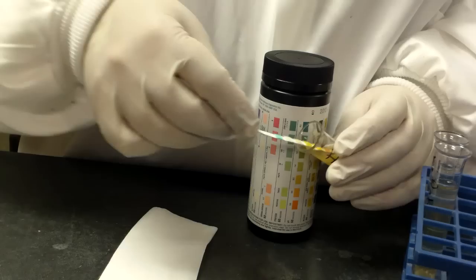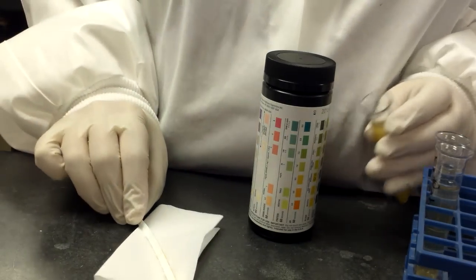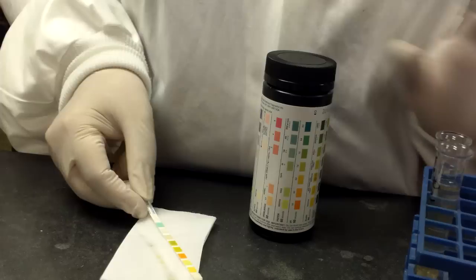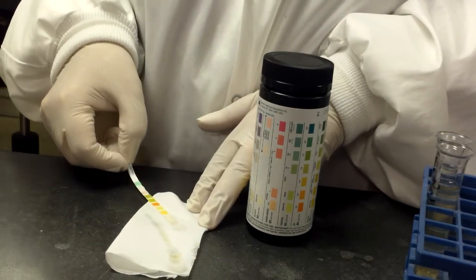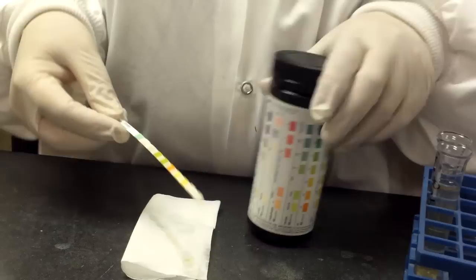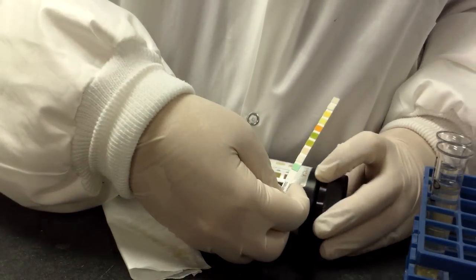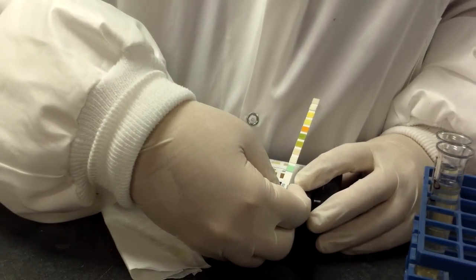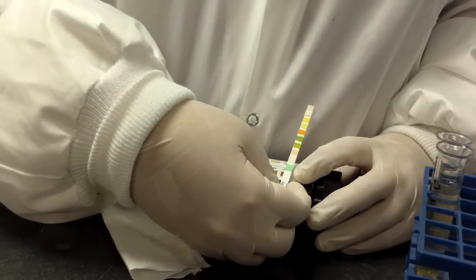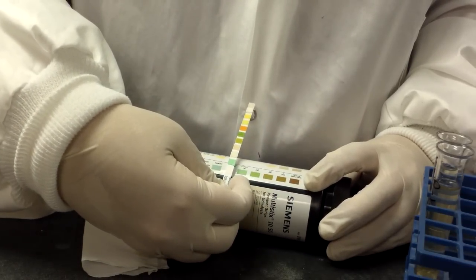So you dip it. I'm going to tap it to make sure I get any excess off. I'm going to wipe the back of it to try and keep the container as clean as possible. At the end of 30 seconds, what I'll do is I will simply compare the color to what it is here on the chart.